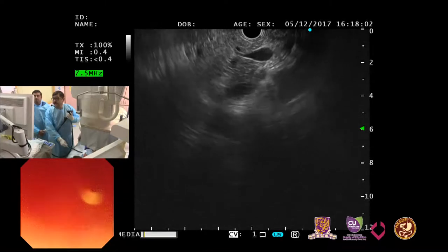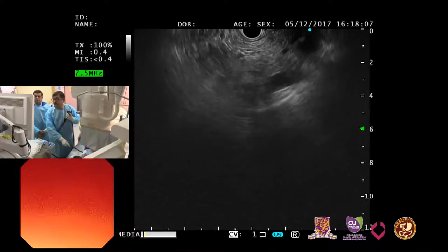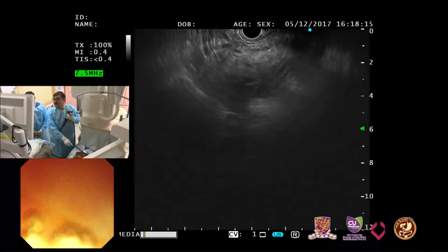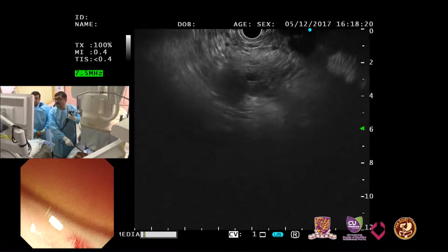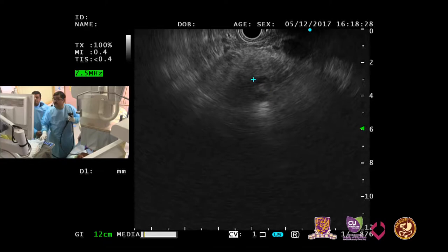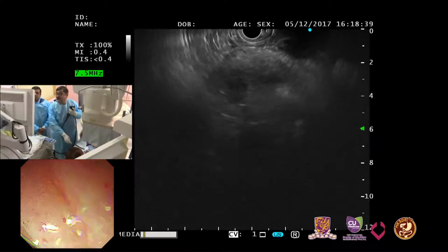So we trace, now you see the head of the pancreas, the bile duct entering behind the pancreas, the pancreatic duct going linear. So you have a dilated bile duct coming all the way till the papilla. See, now the PD also is dilated. Freeze. So, if you see the PD here in the head, this is 5.5 millimeters. So, we are dealing with a dilatation of both CBD and PD.